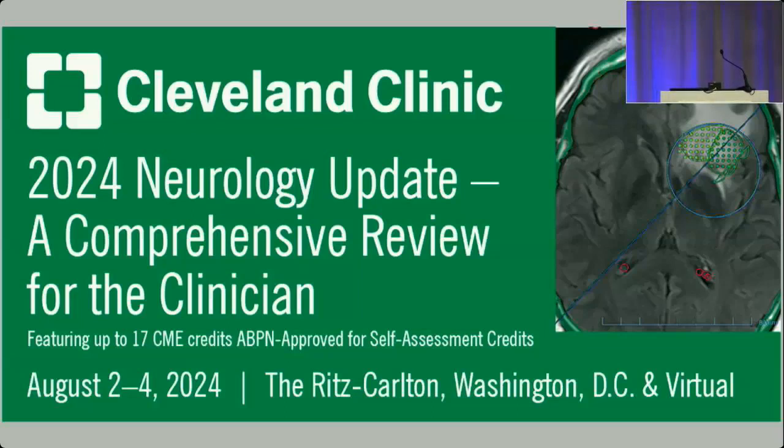Your question relating to status and burst suppression is a little bit more difficult. If you see a patient who's in status and the status has been terminated, typically with intravenous anesthetics, and they go into a burst suppression, that's typically thought of as at least disrupting the motor components of the status. That's typically what we see.